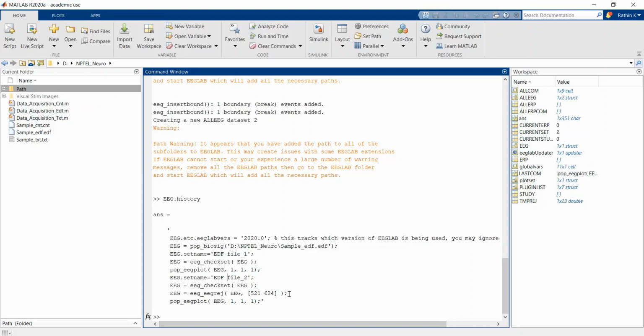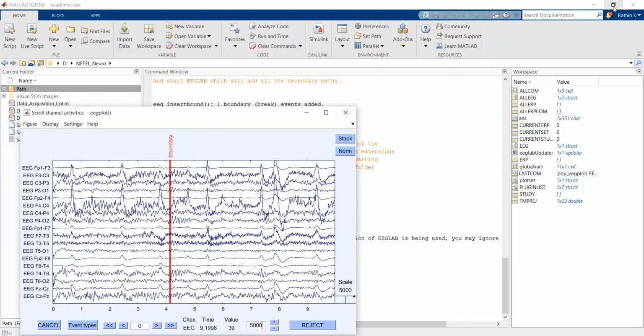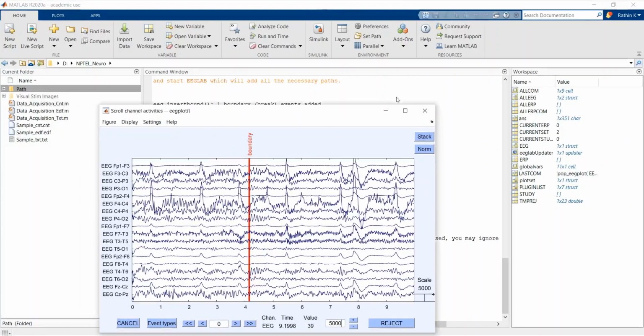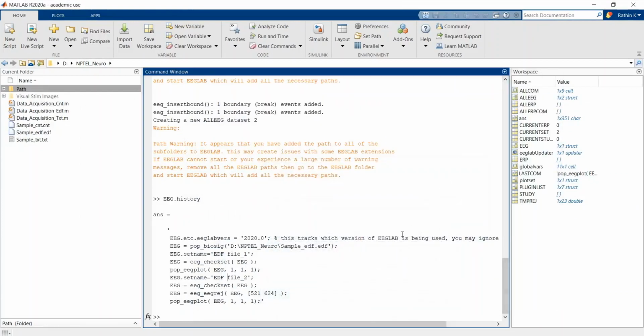Now the GUI looks very easy to use and user friendly. Then why are we going for scripting? We have seen that using the PsychoPy GUI we can generate multiple, various stimuli, and it is very easy instead of writing a Python script for that, which was complex. So why should we emphasize more on scripting?